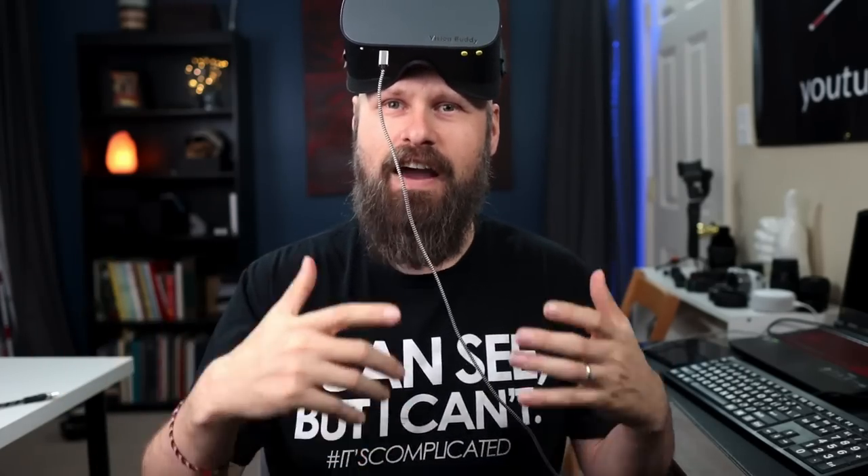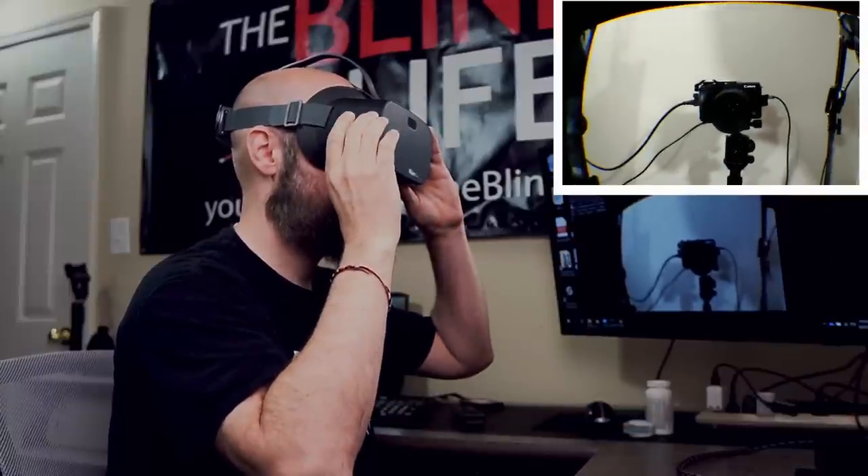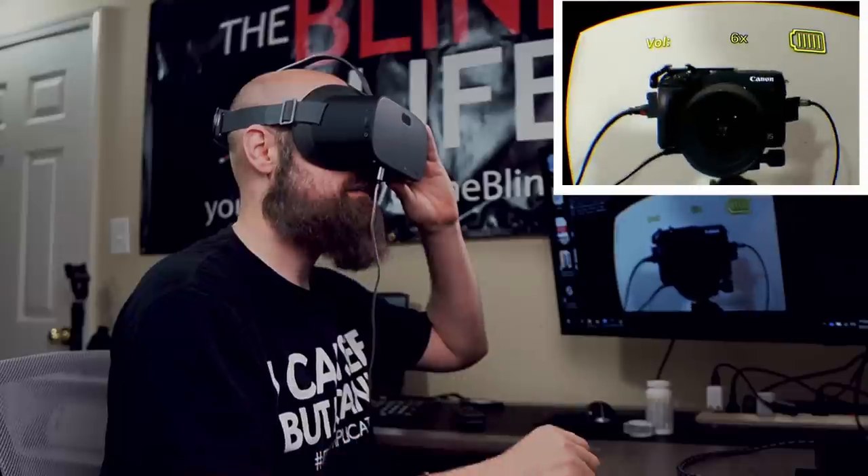I'm doing the screen capture mainly so you can get an idea of how it looks as far as head movement and zooming in, but just remember it's not an accurate representation of how you see it in the headset. The quality is much better in the headset. We're in digital magnification mode now, and we've got controls on the sides — we can zoom in all the way up to 10 times magnification.